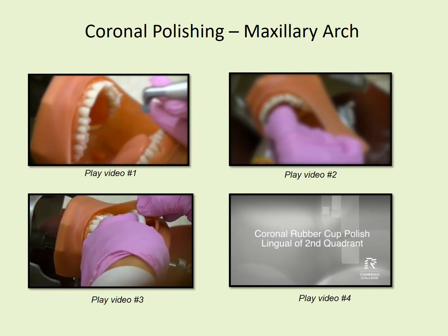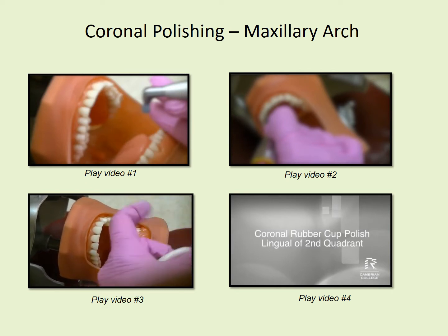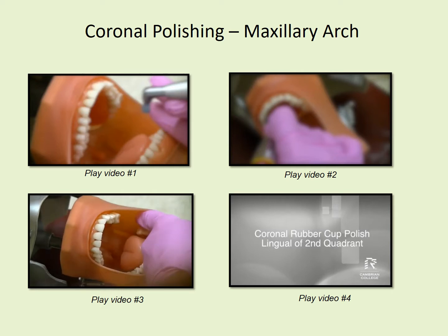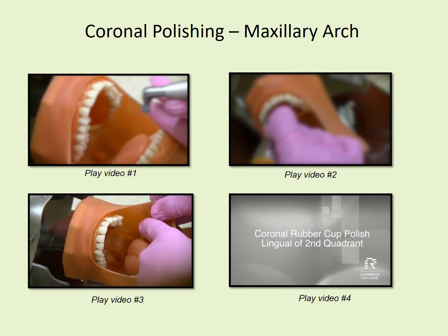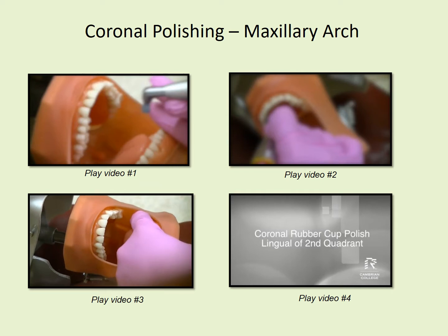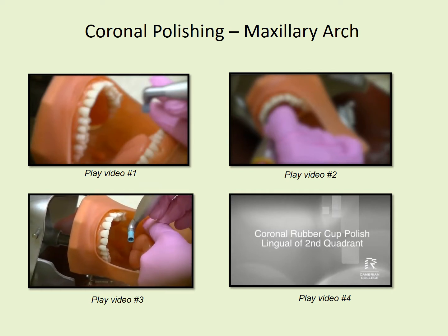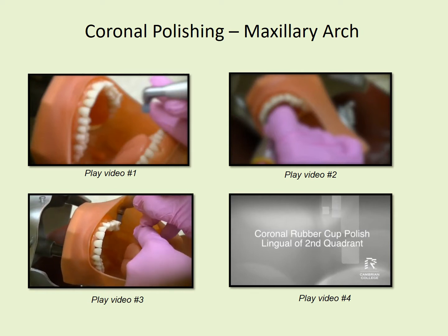Okay, so on your saliva ejector, buccal of the second quadrant we're doing here, prophy paste. You're going to fulcrum with your index finger. Put your index finger on the occlusals of the third quadrant posteriors and have the client close. Get your fulcrum on the index finger, so it's called a built-up fulcrum. Retract with the back of the handpiece.